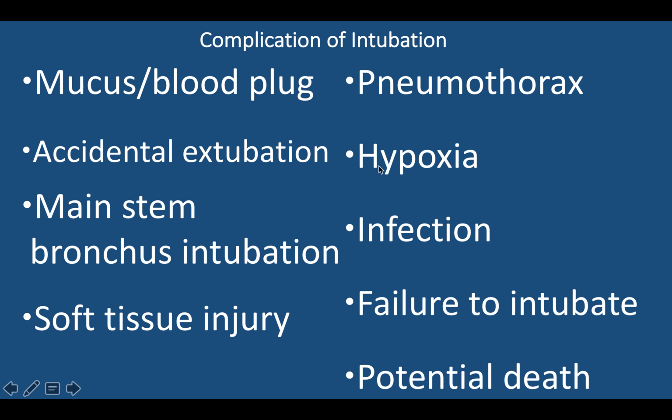And finally, complications of intubation are numerous. The most common ones would be a simple mucus plug or blood, an accidental extubation, which can happen at any time after the intubation, and a main stem bronchus intubation, which we're going to hope we don't do based on our vocal cord guide and chest x-ray following the procedure. You can have lots of soft tissue injury, especially if you're anxious during the procedure. Please make sure you are always gentle with the infant, no matter how worried you may be in the situation.